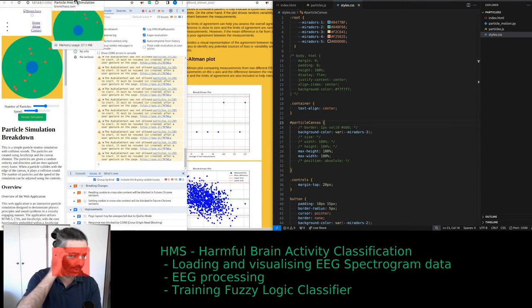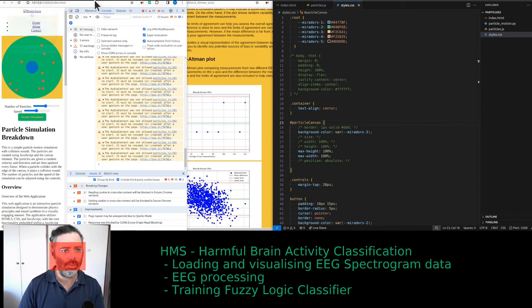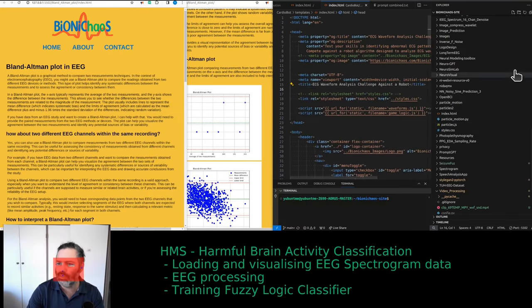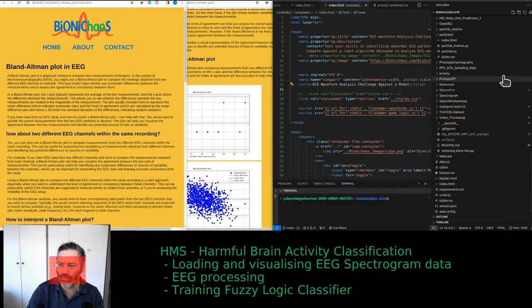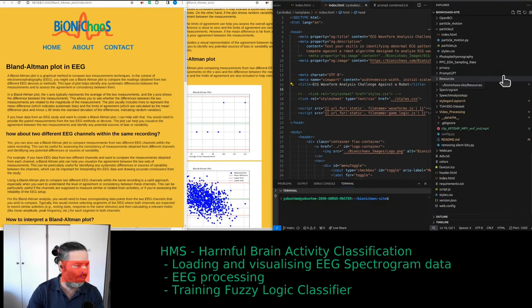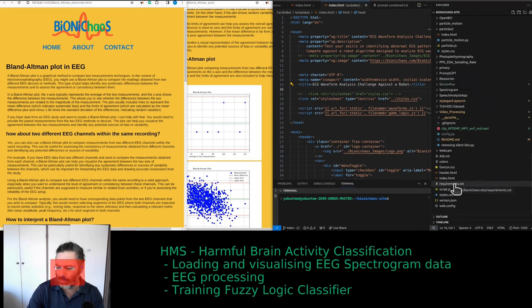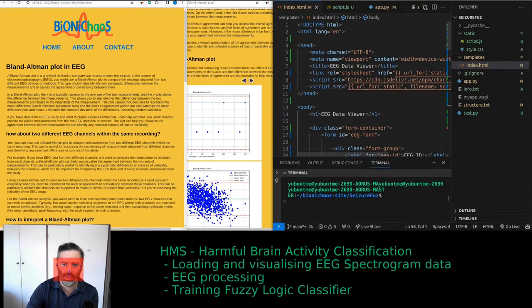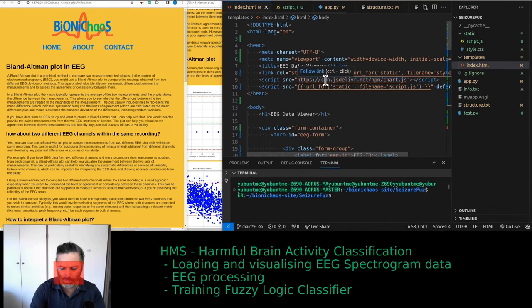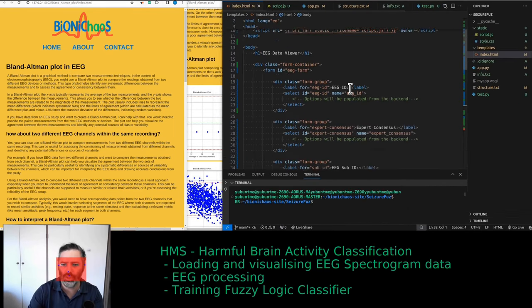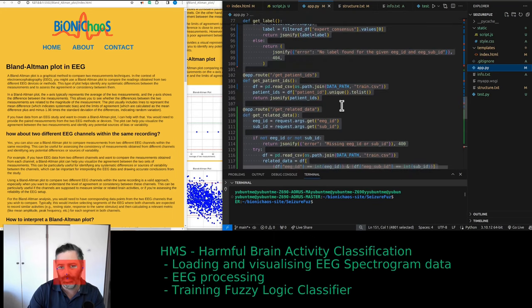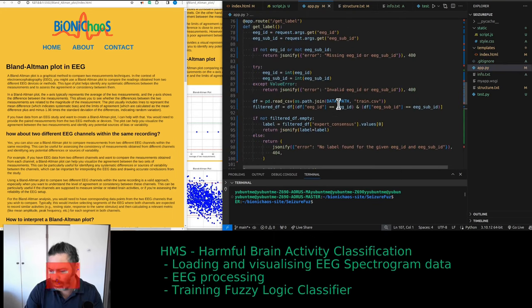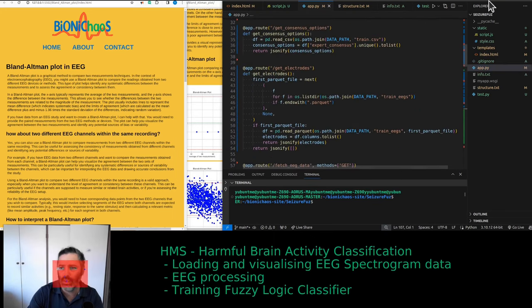We have a tool called SeizureFuz because we're applying fuzzy logic to seizures. This uses the Kaggle competition data — we're loading data from it and trying to display it.